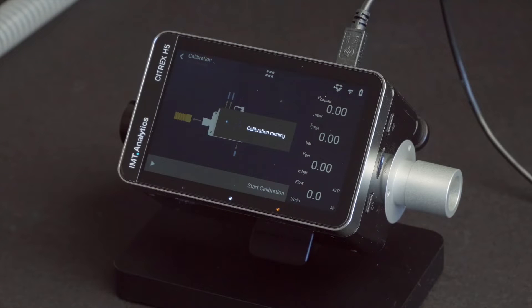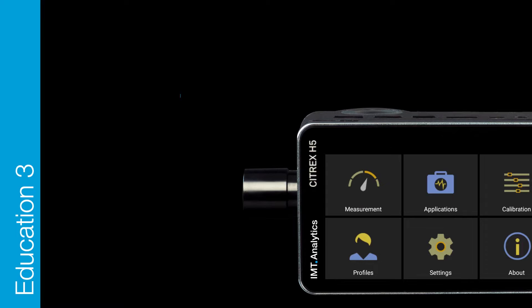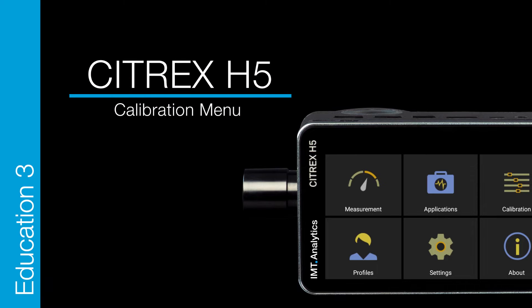Citrex H5 Education. Zero offset calibration is an important function to guarantee precise measurements. It needs only a few seconds and the zero calibration is done.